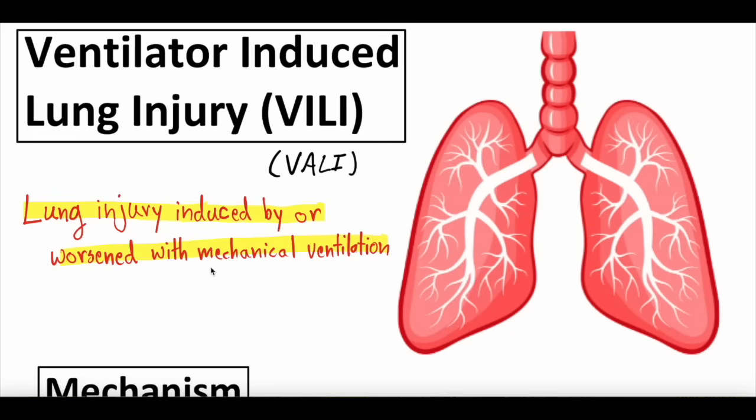When you're on a ventilator, though, obviously we see this in the clinical arena. The ventilator is not your lungs. It's not your body. It's a machine. And although we do everything we can to optimize that machine, it's still not a perfect modality for patients, because that machine administers air. It pumps air in and out.